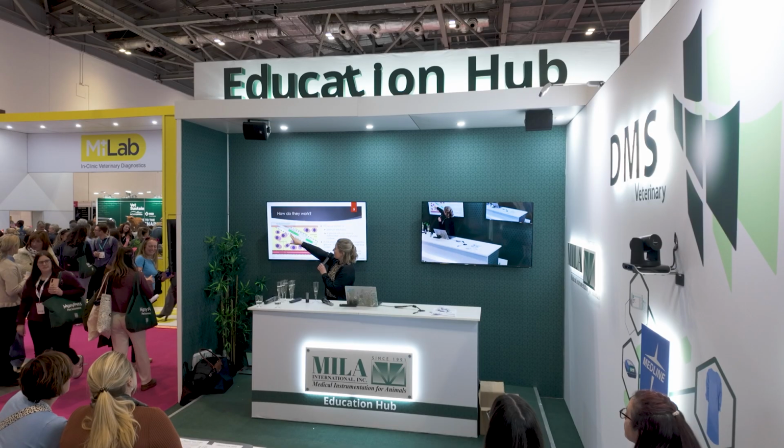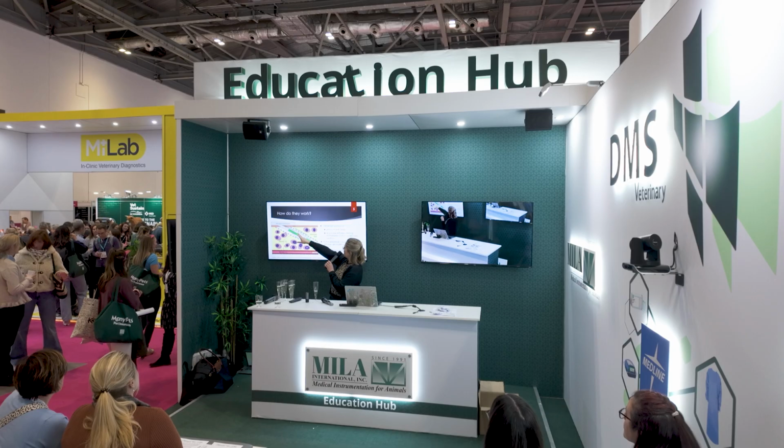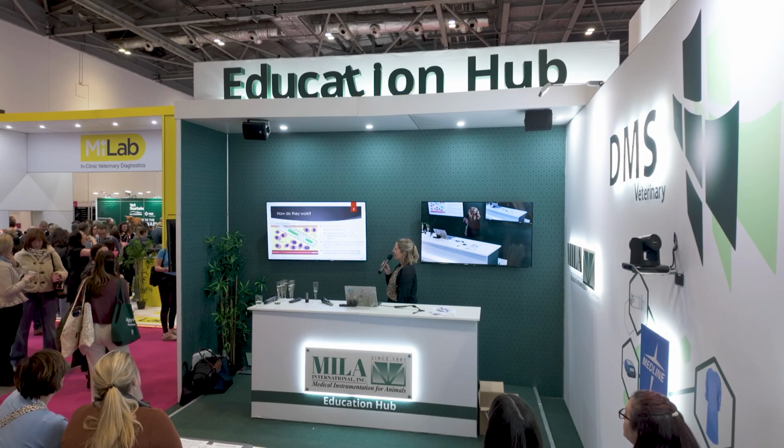Now, the way that these sensors work, and I've borrowed this picture from a very nice article referenced at the bottom in Vet Times, which Ian has written on glucose monitors. They have this very small sensor, as we have said, which sits on the outside of the patient's skin, and we have this little platinum electrode which is deployed through the skin and sits in that interstitial space.